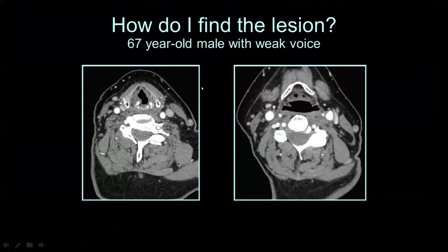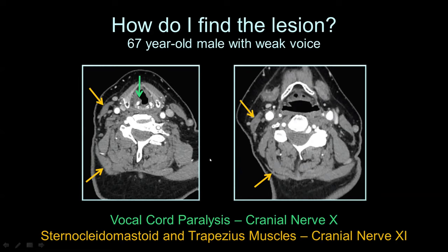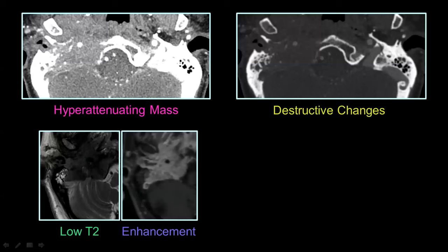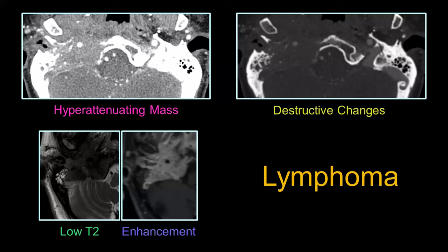Here's a 67-year-old male with a weak voice. Axial CT shows right vocal cord paralysis with posterior medial rotation. You then look for ancillary findings and notice fat loss along the right neck and loss of muscle bulk in the right sternocleidomastoid and trapezius muscles — indicating cranial nerve 11 is also involved. So you have CN10 and CN11 together, which means heading right up to the skull base. There you find a hyperattenuating mass that has destroyed the bone at the right skull base — low T2 signal on MRI with intense enhancement. This was lymphoma involving the skull base causing vocal cord paralysis.